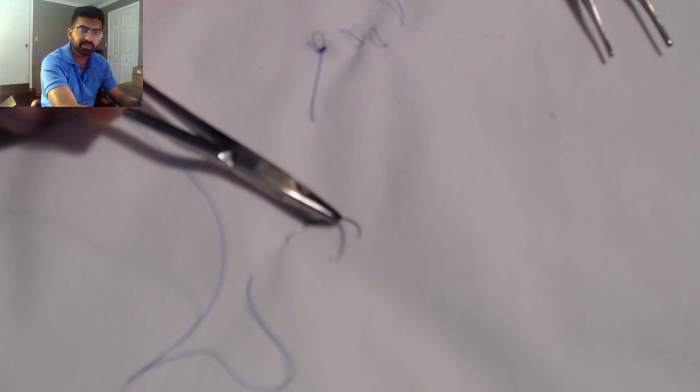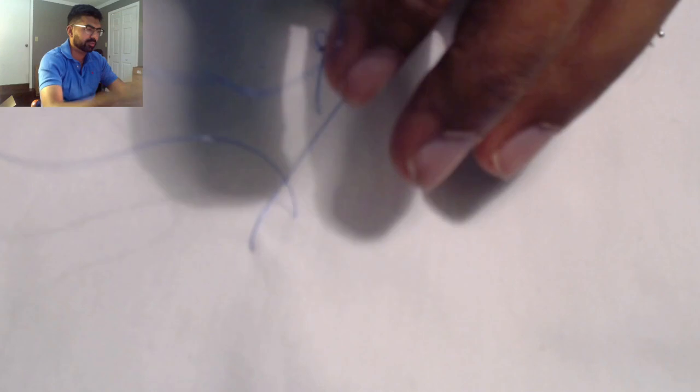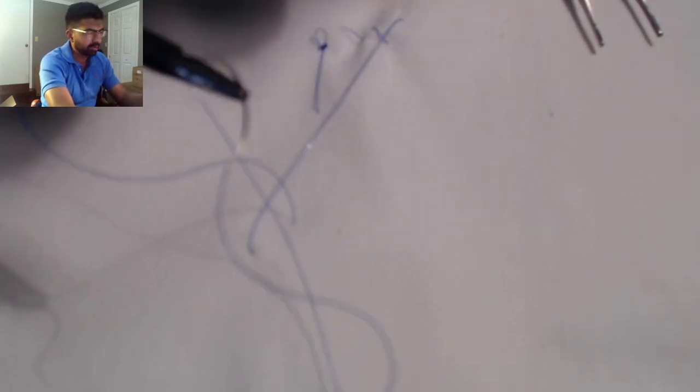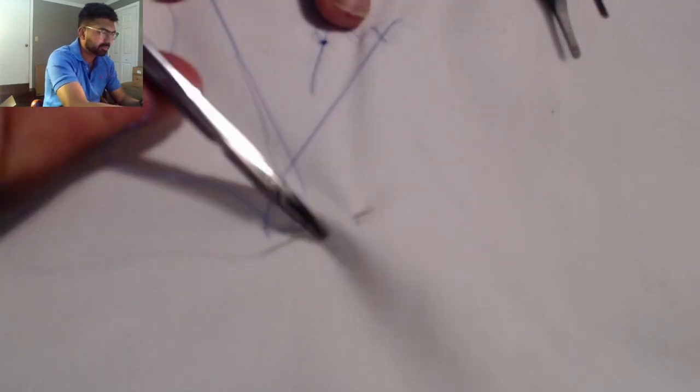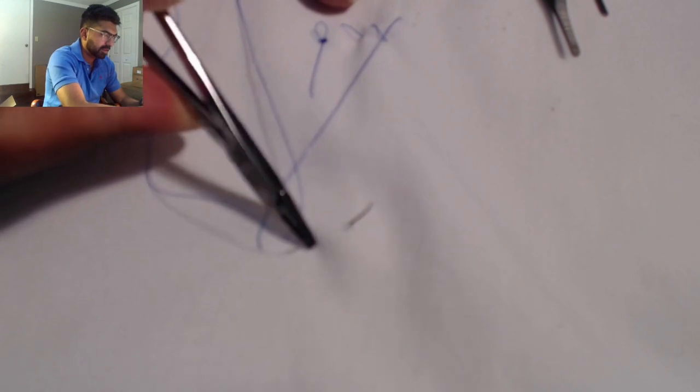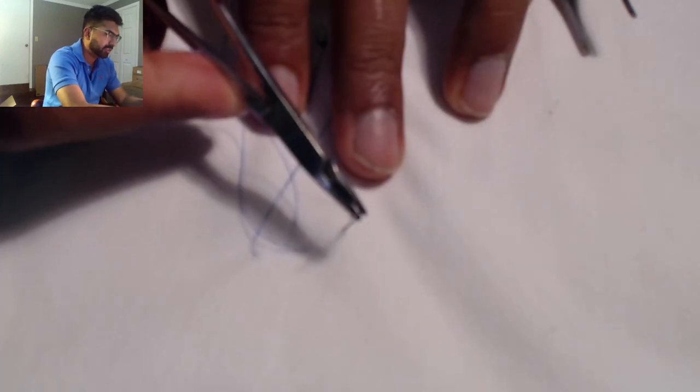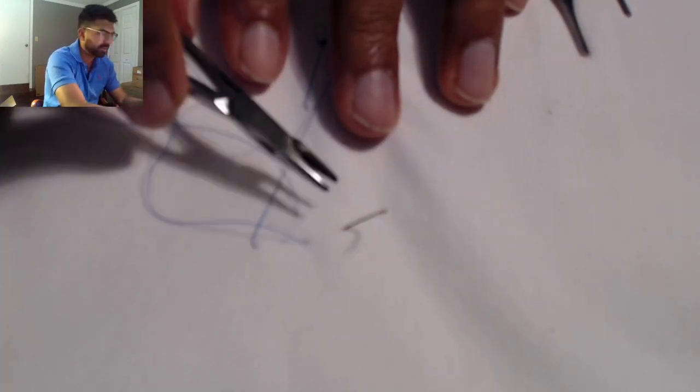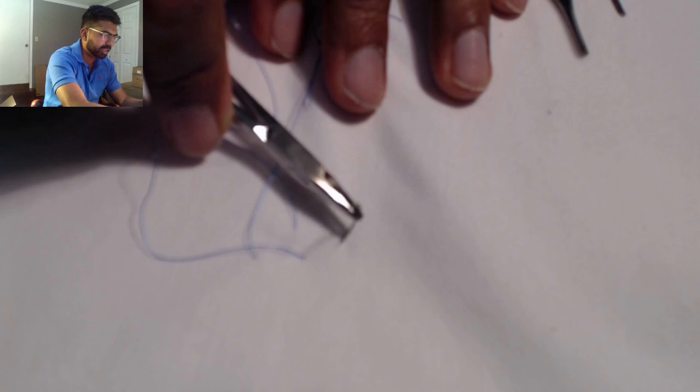Once I grab at the 50 percent mark, if I push the needle it'll go away from me. If I pull the needle it'll come towards me. That's how you are able to reload the needle without using your left hand or pickups. I'll show you that one more time. Taking the bite, letting the needle slide through, I'm pronating, pulling it so that only 75 percent of the needle is sticking inside the tissue, exposing the 50 percent mark.